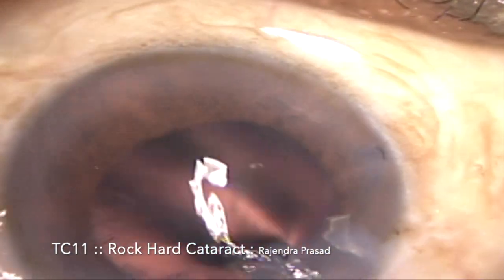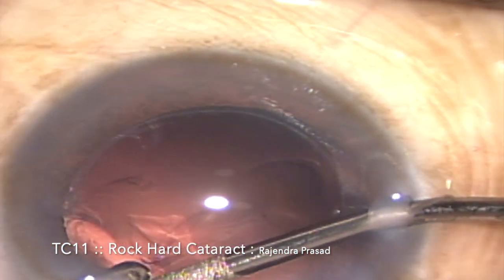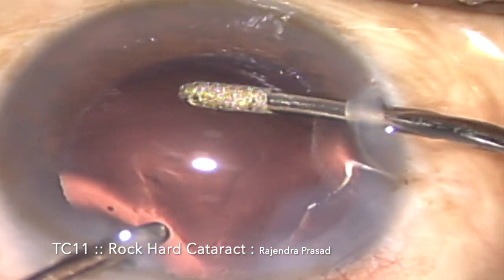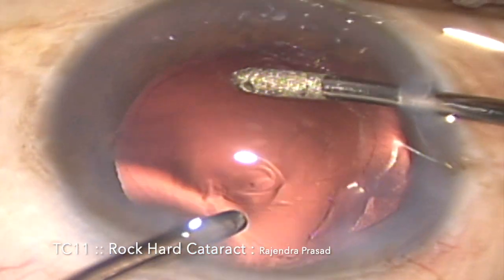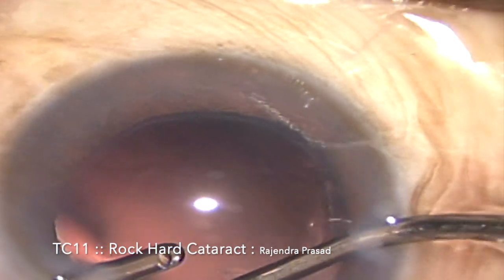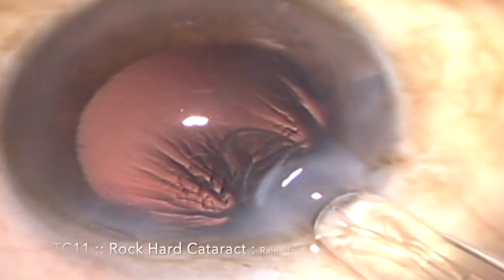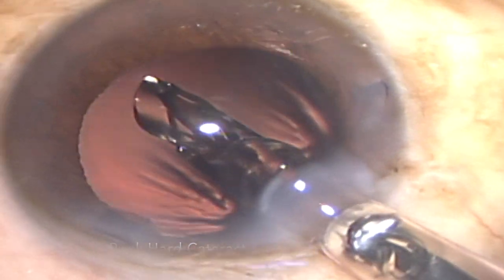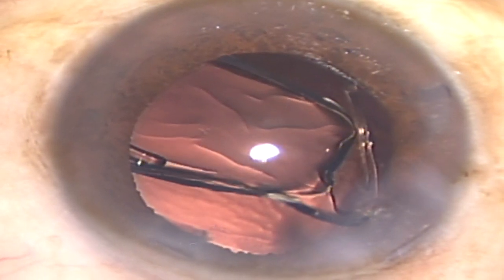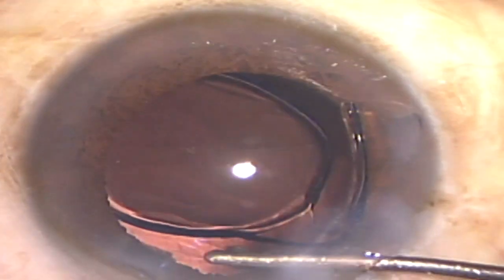Once the emulsification procedure is complete, we can see that there isn't much cortical or epinuclear material in this particular case. Whatever cortical material is present is being aspirated with the help of bimanual irrigation and aspiration cannula. Once aspiration is complete, I'm injecting a one-piece IOL into the capsular bag. The leading haptic has already gone into the capsular bag and I'm dialing the trailing haptic into the capsular bag. The red reflex is very clear now.